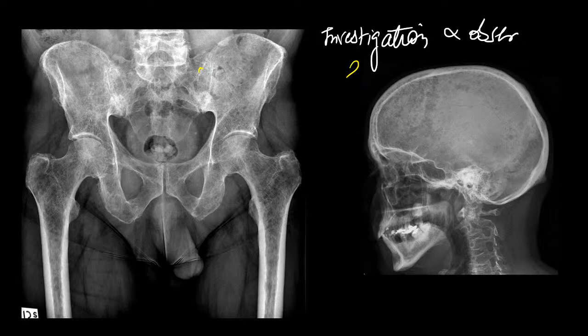Very good. The investigation that is being shown to you is an X-ray of the pelvis as well as a lateral view of the skull, right?